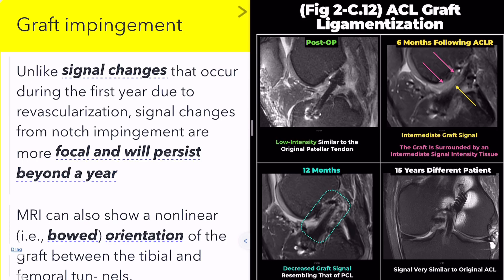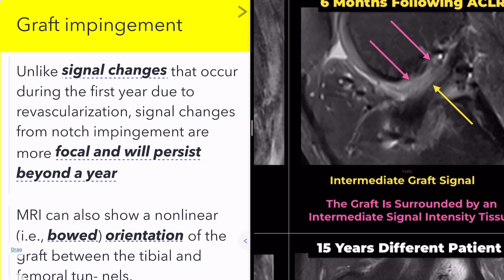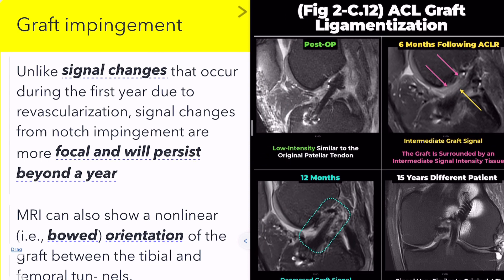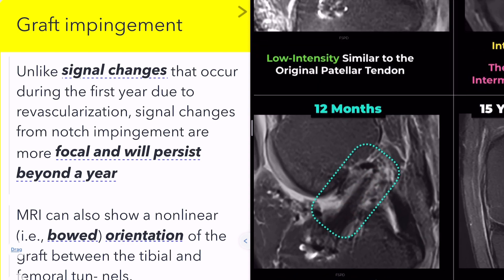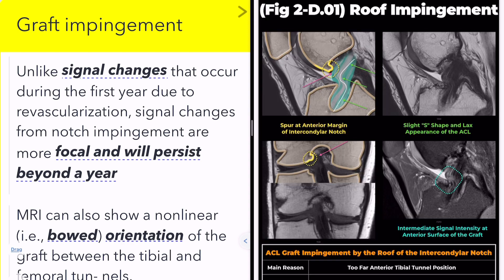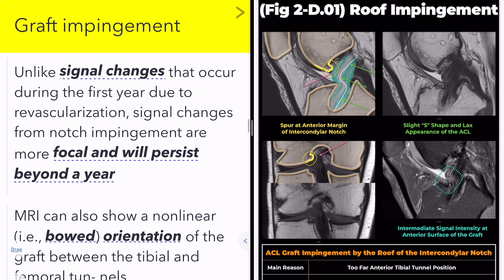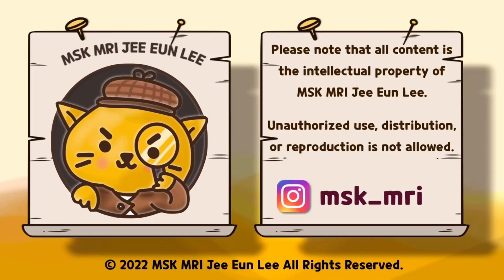Let's look at the case here. This image was taken 6 months post-surgery. Compared to the previous MRI, the graft is now surrounded by intermediate signal intensity tissue. This patient is exhibiting normal ACL graft ligamentization rather than roof impingement. When increased signal changes are observed in the ACL graft, it's crucial to differentiate impingement from ligamentization. If the surrounding signal is intermediate, typically between 4 to 8 months, and decreases over time, this is likely ligamentization. However, persistent signal changes in areas contacting osteophytes or showing posterior bowing due to impingement, even after a year, suggest roof impingement rather than ligamentization.